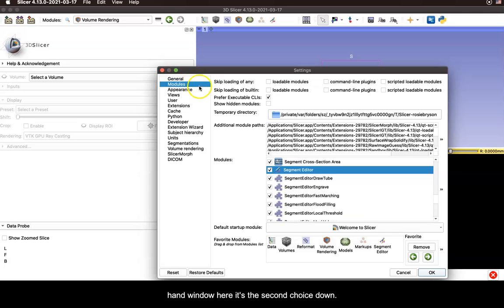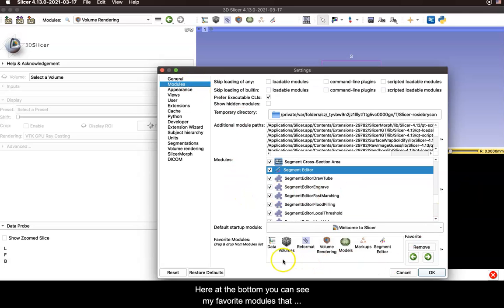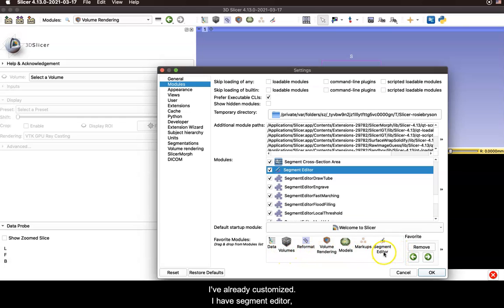It's the second choice down and then here at the bottom you can see my favorite modules that I've already customized. I have segment editor, markups, models, and so on.